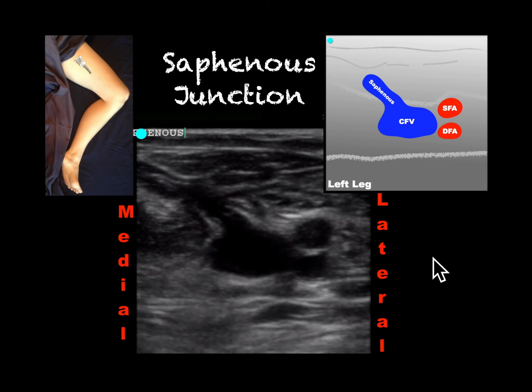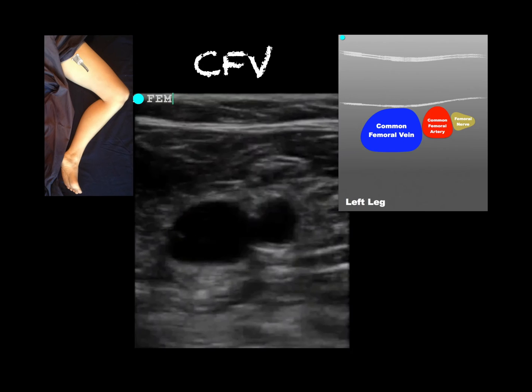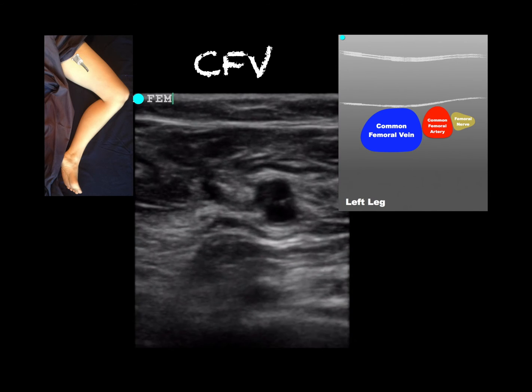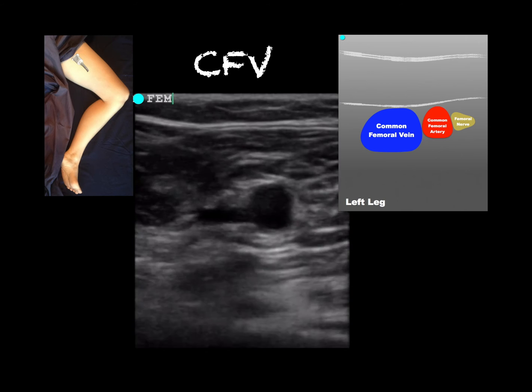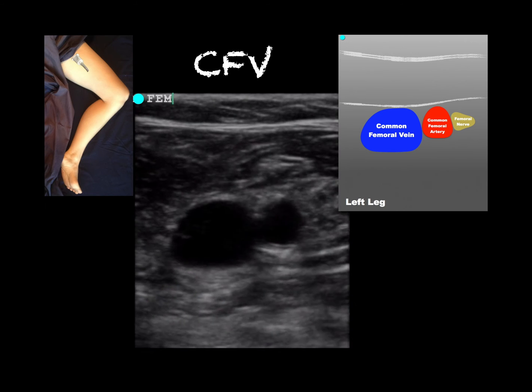From the saphenous junction, move the probe superior to find the common femoral vein. When we look at the common femoral vein, we can see the artery there again, and here's the vein. Remember that on the left leg, this is lateral and this is medial. When we compress here, we just make sure those two walls touch — which they do. You can see a valve flickering in the vein at the junction — that's normal, don't worry about it.